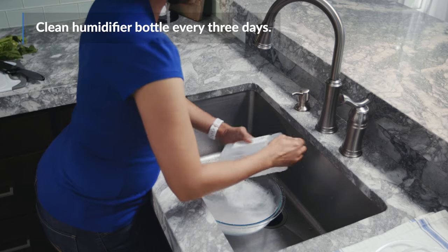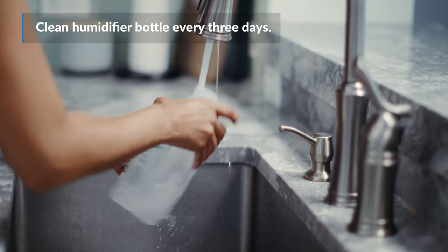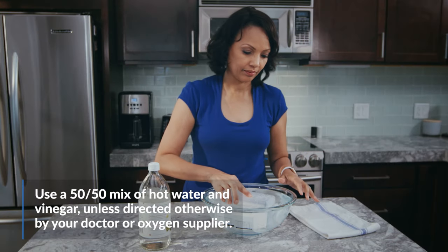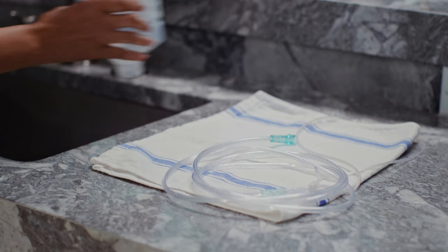Clean your humidifier bottle every three days with warm water and mild dish soap. Make sure you rinse out all of the soap with hot water. Then soak it in a vinegar and water solution for a few minutes to help get rid of any extra bacteria. Dry the bottle with a paper towel and then let it air dry.